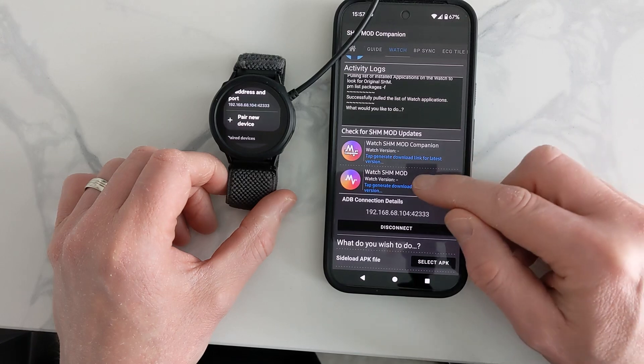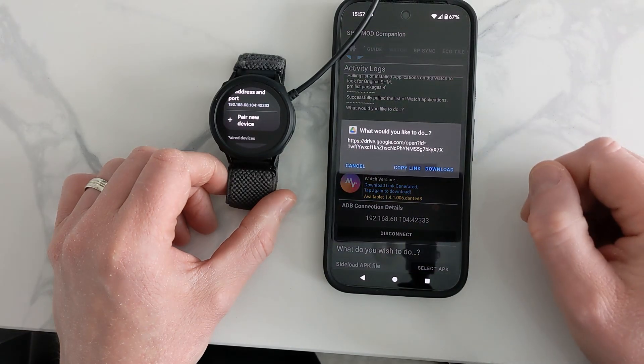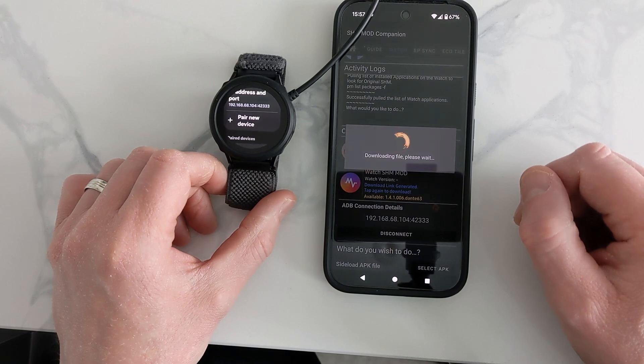Now we need to get the app for the watch. We need to download it to our phone and then send it to the watch. Click this option, then click the download button, and let it download.